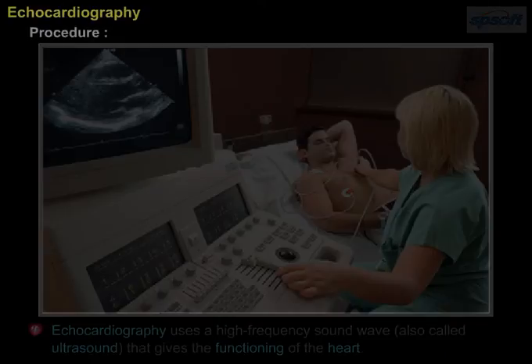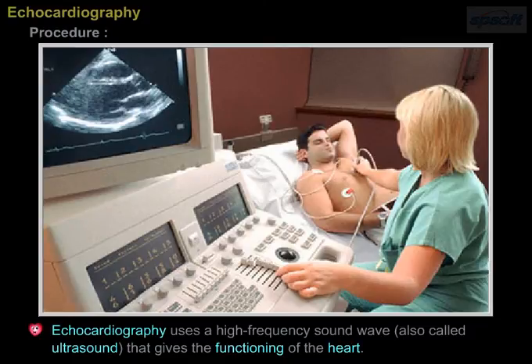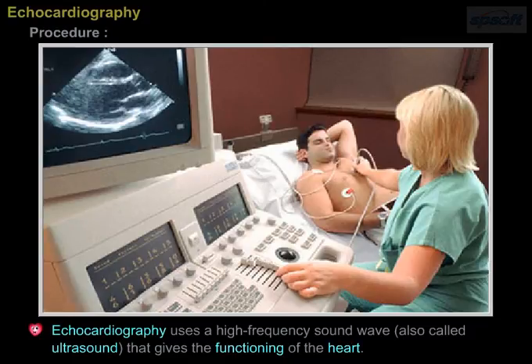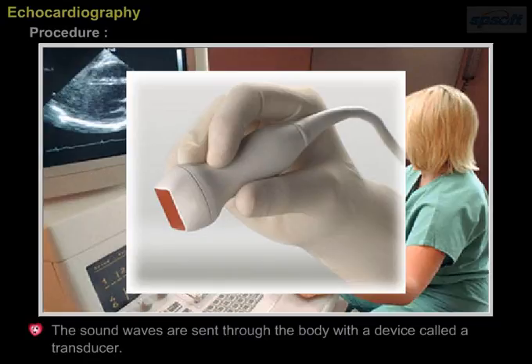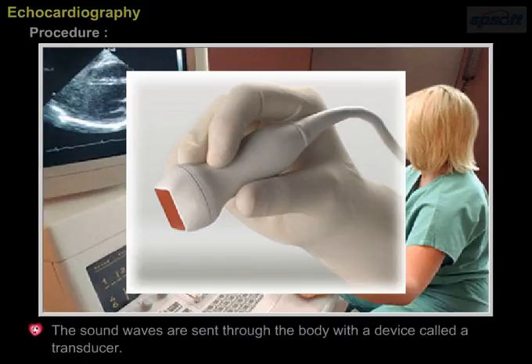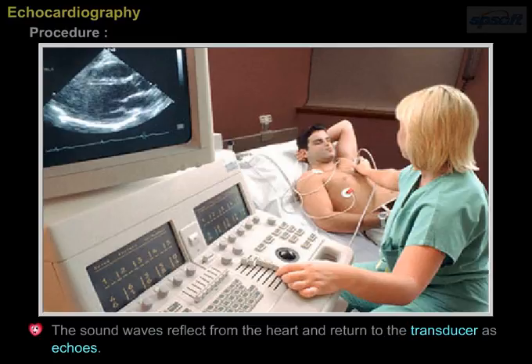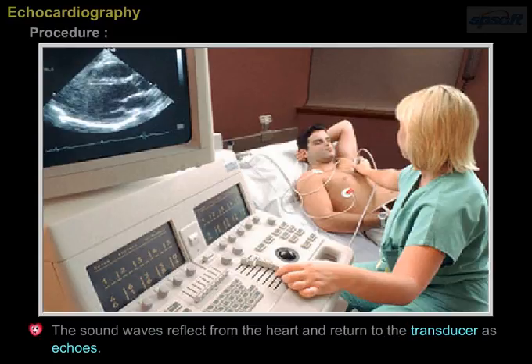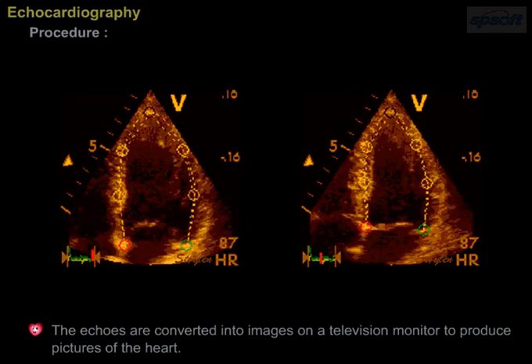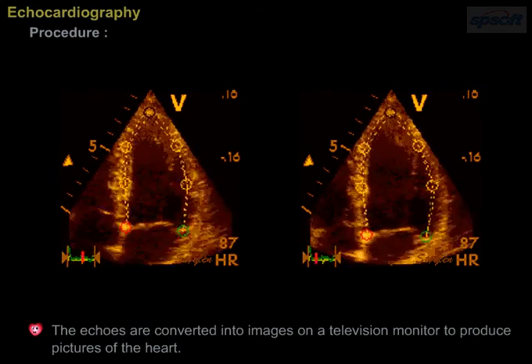Echocardiography uses high frequency sound waves, also called ultrasound, to assess the functioning of the heart. The sound waves are sent through the body with a device called a transducer. The sound waves reflect from the heart and return to the transducer as echoes, which are then converted into images on a television monitor.